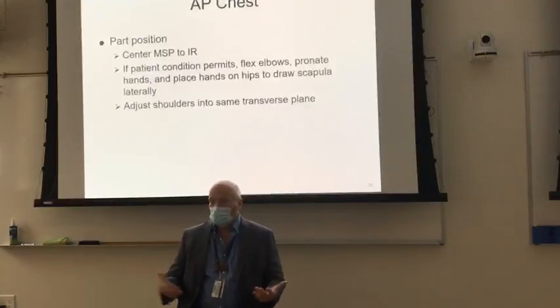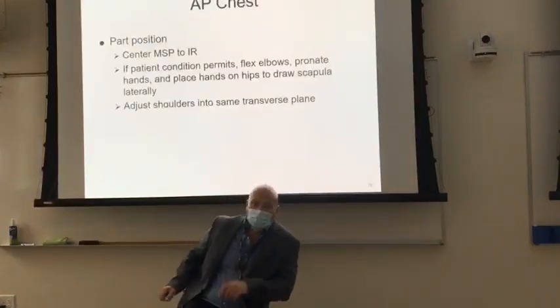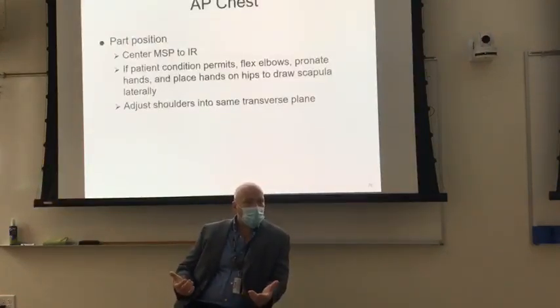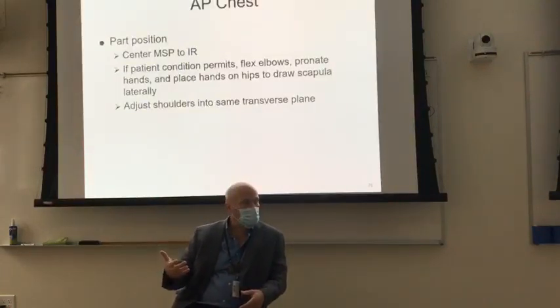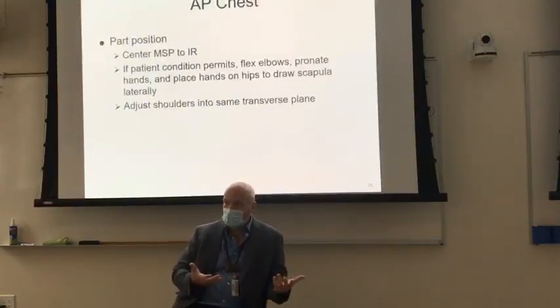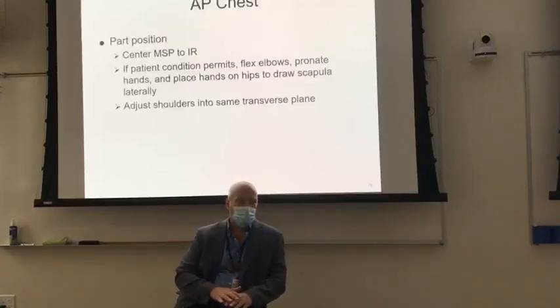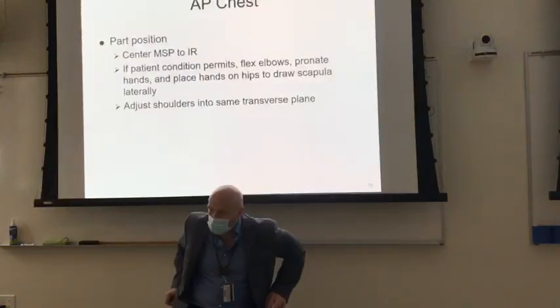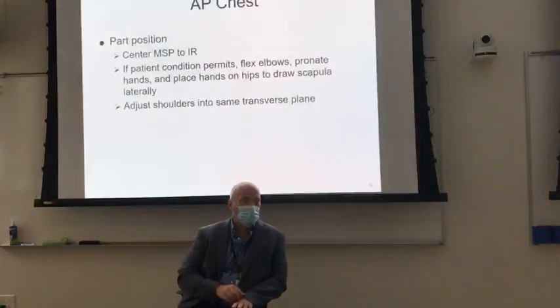So that's number one. Number two is that if the patient is sitting at a bit of an angle, maybe you walk in and they're positioned far enough up in the bed that you don't need to pull them up, use the draw sheet in that case to straighten them out. Remember, these patients are really sick. So if you walk in, they're comfortable, they found a comfortable position, you tell them, I want you to straighten up in bed. What they're gonna do is they're gonna struggle and they're gonna push and they're gonna groan and they're gonna fall right back into the exact same position they were in before.